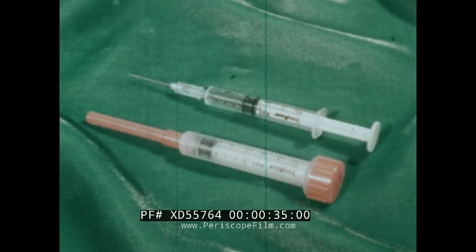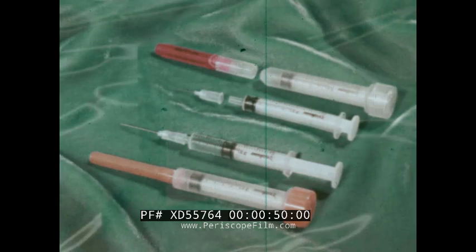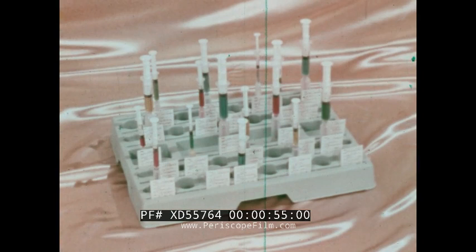As the originators of sterile disposable needles, Sherwood feels the use of disposable syringes and needles imposes upon the manufacturer the obligation to develop a system of handling which guarantees continuous safety from the selection of raw materials to the disposal of the used unit.